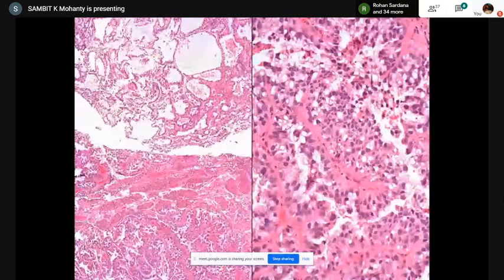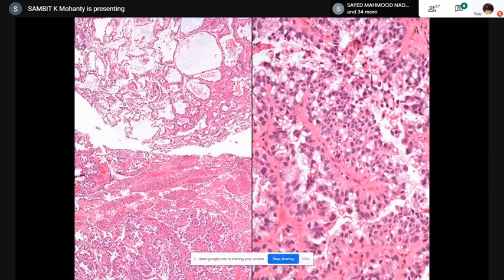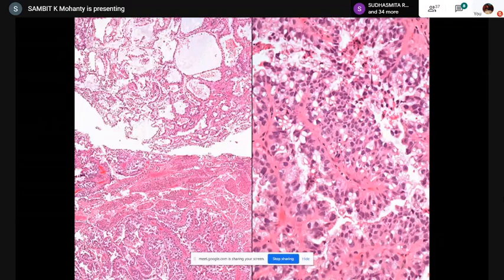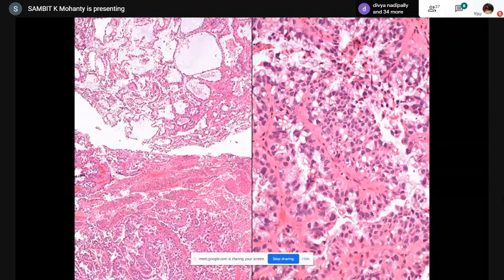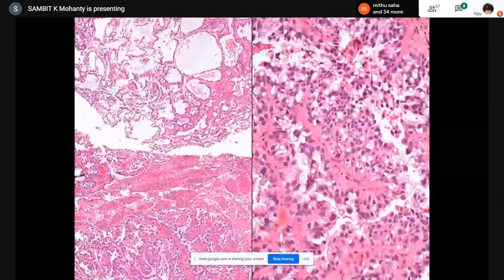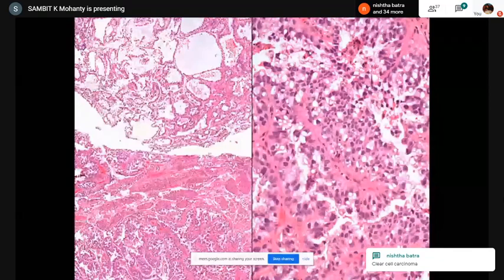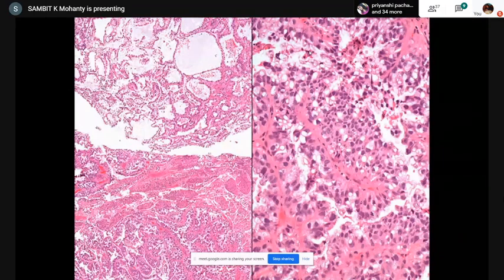On the transurethral resection specimen, the tumor had variable histology: cystic areas and solid nesting pattern, infiltrating the musculature — at least pT2 lesion. Cystic areas were lined by atrophic tubules, with some cells having voluminous cytoplasm and hobnailing where the nucleus protrudes out of the cell, and some without hobnailing but with prominent clearing. My first thought was bladder adenocarcinoma, probably infiltrating the bladder wall — a clear cell adenocarcinoma.